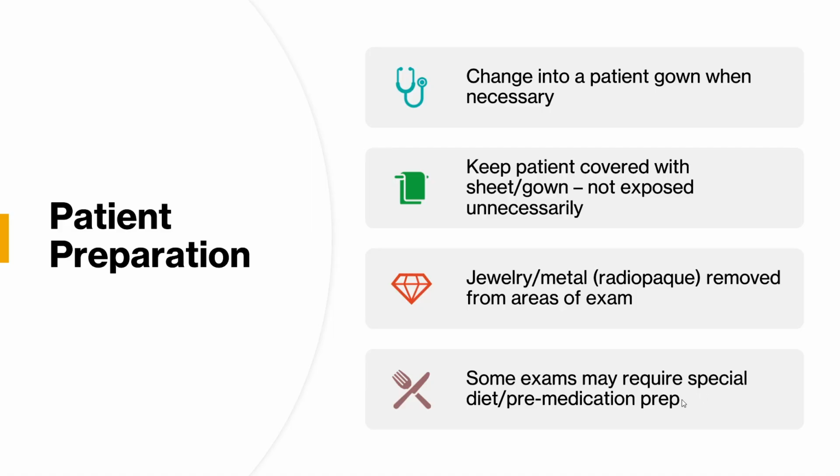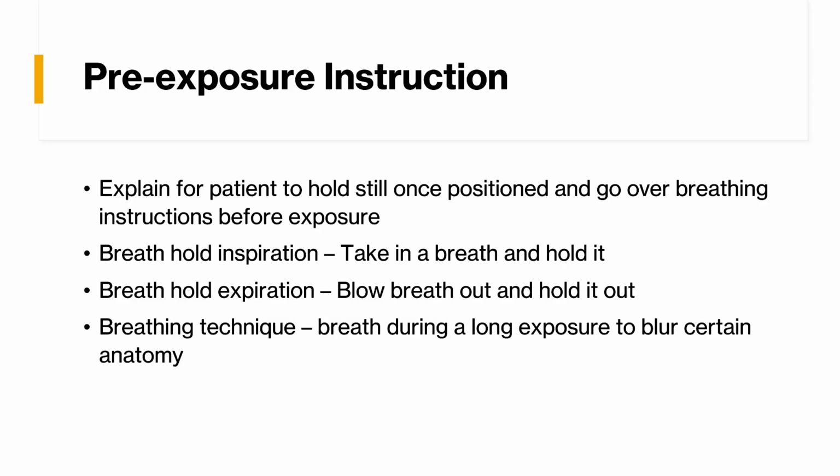Some exams, especially with some interventional procedures or some that require contrast, will require special diet or pre-med prep. So depending on the setting that you're working in, that might be something that you have to administer or prep the patient on.